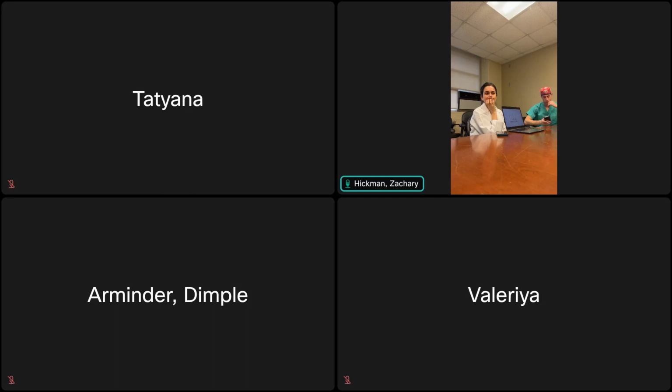And then the other time you'll see it is in somebody with borderline high or high ICP. On the waveform, it starts to look like a triangle, as opposed to going up and then coming down. It looks more triangular. That's a bad sign. Any additional increase in volume of anything in the brain, whether it's CSF, blood, or edema, is going to cause a very large increase in their ICP.